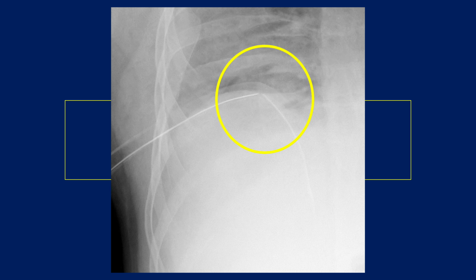Now let's discuss what is swinging and bubbling. This is based on the changes of interpleural pressure. During inspiration, for swinging, the interpleural pressure becomes more negative and then fluid rises in the tube. And during expiration it becomes less negative and therefore falls. Whilst bubbling, on expiration, air escapes from the pleural space via the drain and this causes bubbling within the water.